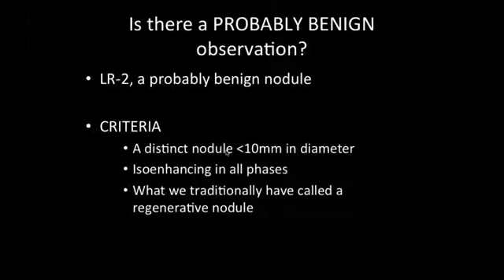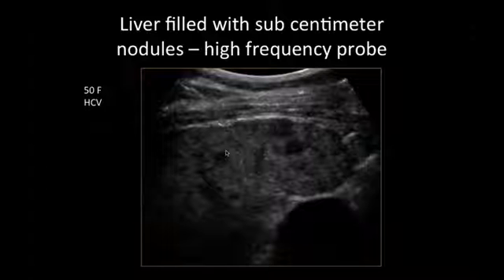And then again, we do portal venous phase sweeps regularly, but intermittently throughout the portal venous phase. And you can see that contrast-enhanced ultrasound in many situations actually makes a very nodular liver look very homogeneous in the portal venous phase, improving the confidence of the investigator and removing these nodules from consideration. So this would be an LR2 liver.